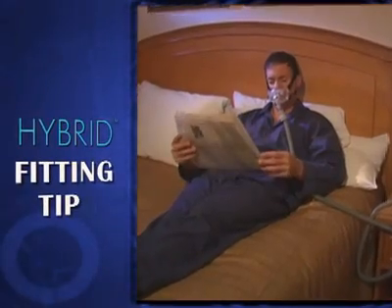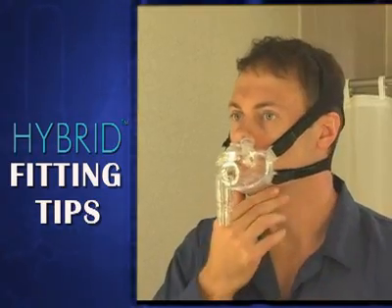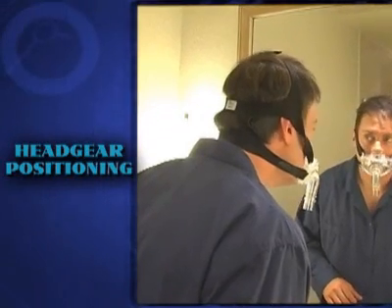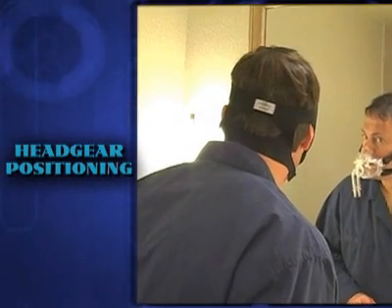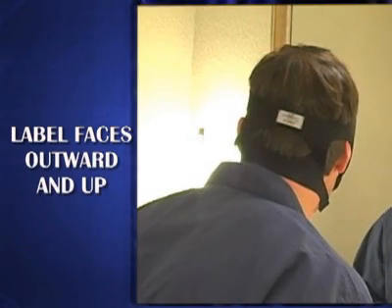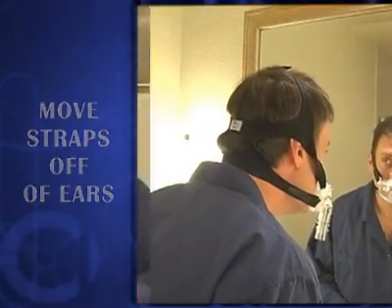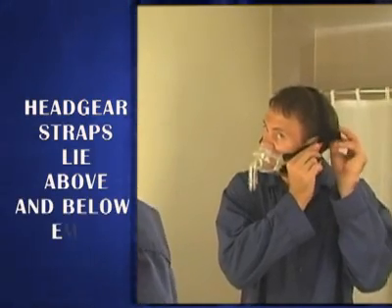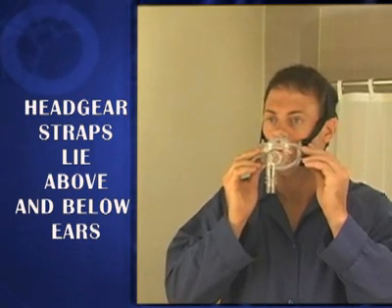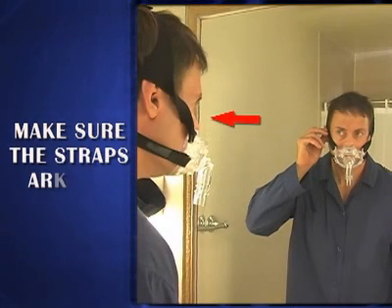The comfort of your hybrid universal interface can be further enhanced and leaks can be minimized by following a few simple steps. Make sure the headgear is appropriately worn. The label on the headgear should face outward and up. Move the headgear straps off of the ears. The four straps on the side should lie completely above and below your ears. Make sure that the straps are not twisted.